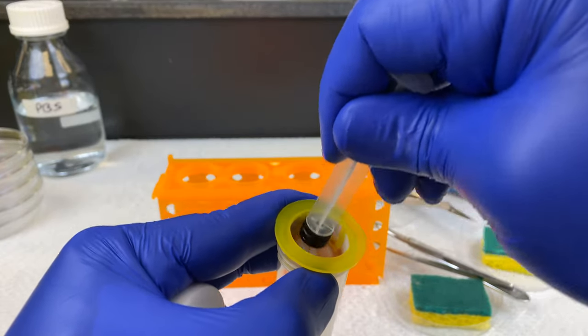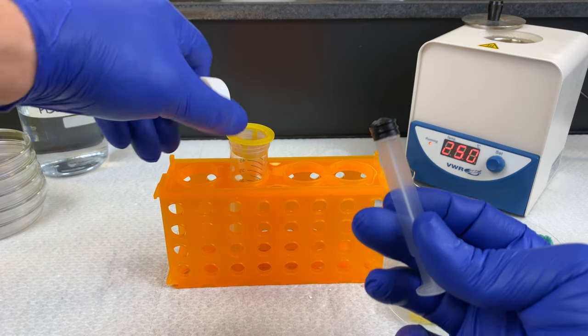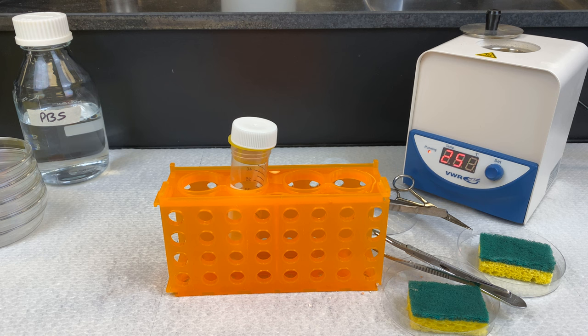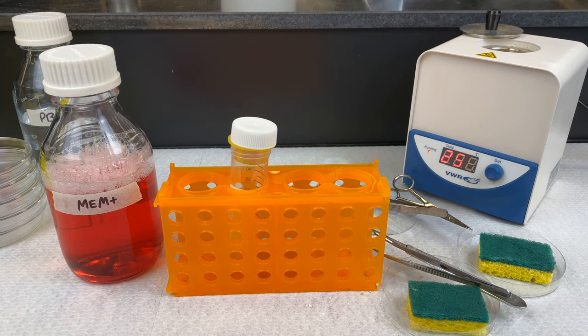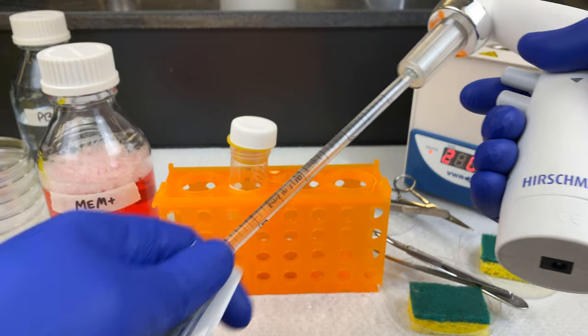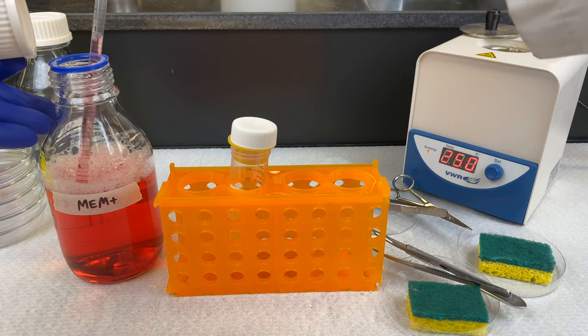We are pushing the whole liver through this cell strainer. Don't worry about getting the entire liver through — we just need enough cells that we can culture. Now that we've applied pressure and broken apart the cells, we will now place some media into our flask. We're going to be using our MEM, our minimal essential media. We'll use a serological pipette to pipette about 5 mils of media through the strainer. This will wash any of the cells that have been broken apart through the strainer and into the bottom of the 50-mil conical tube.